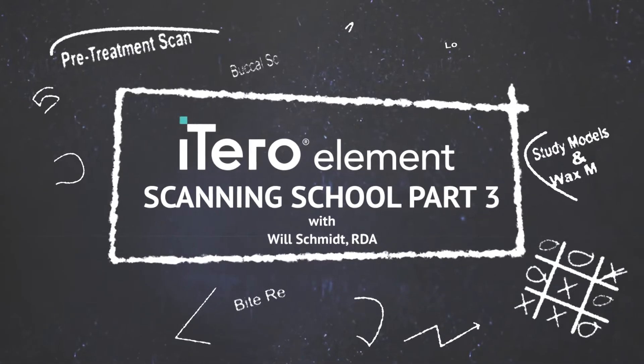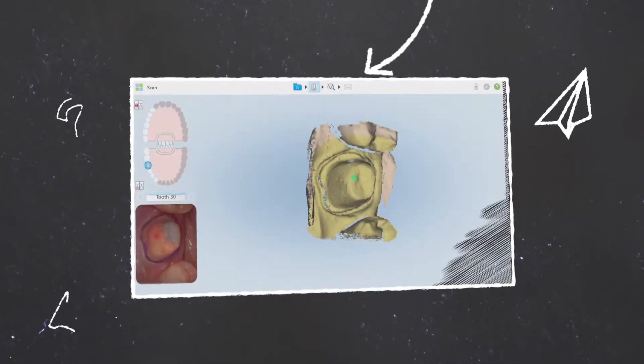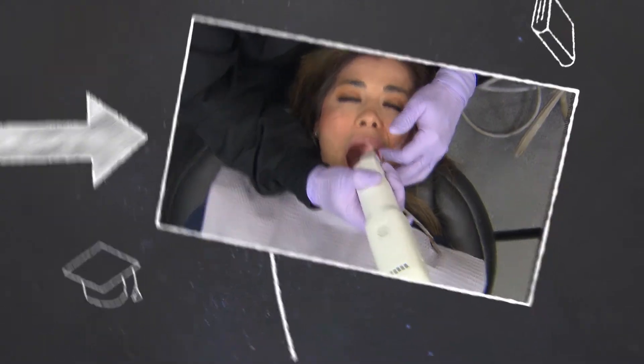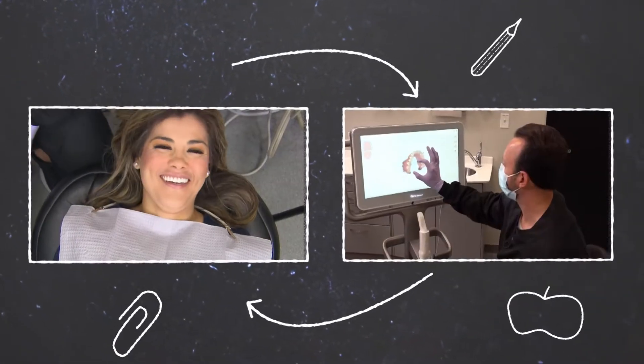Our doctors are going to show us two different techniques for cord retraction. Welcome back to iTero scanning school. I'm going to jump right into this single unit crown prep scan for this patient's tooth number 30. If this is your first time watching the iTero Element in action, take a moment and review my previous episodes where I discuss the basics of iTero function and setup.